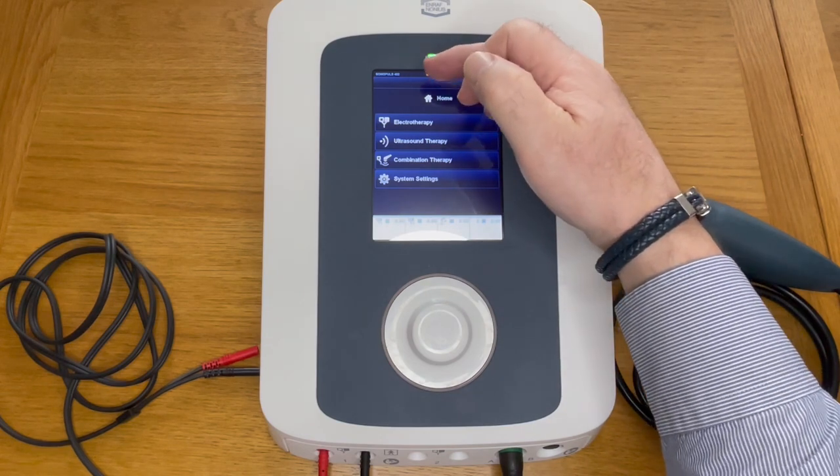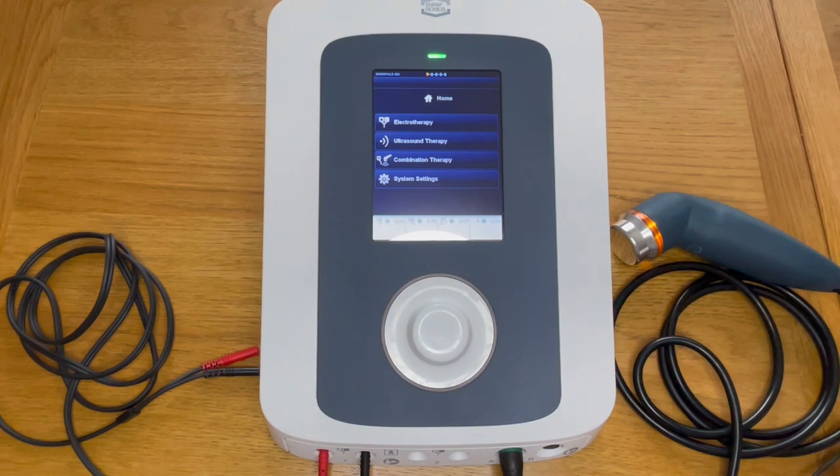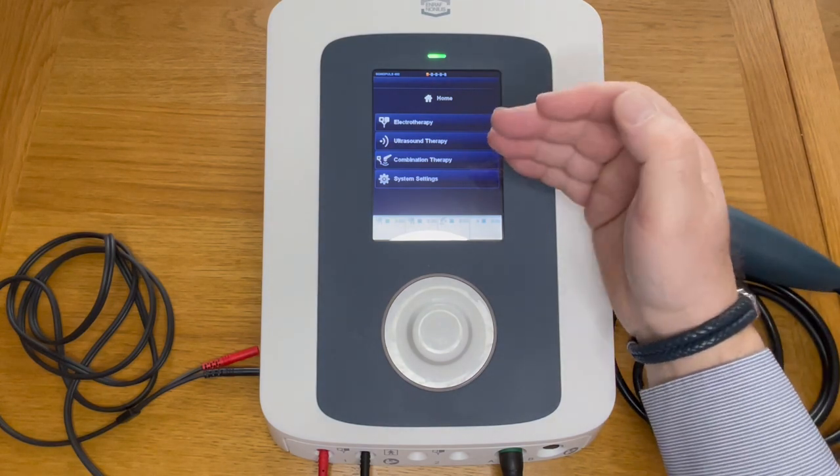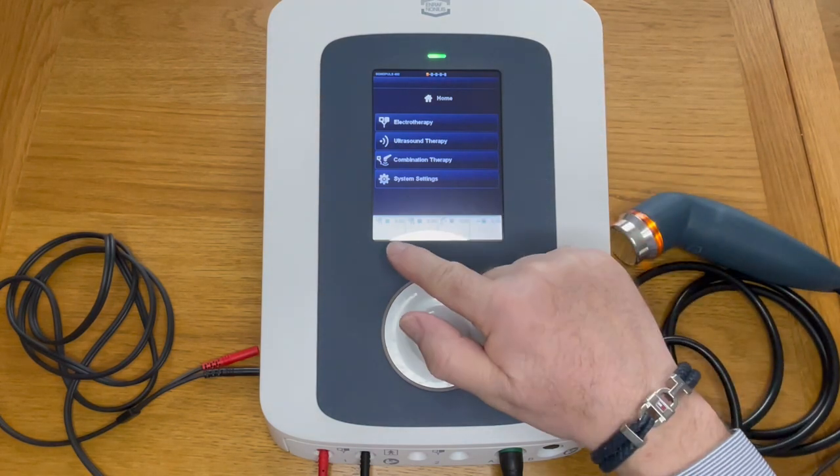On the display you can see we've got a home screen. At the top of the home screen we've got little key bars that will tell you how far you're into the menu and how far you are into each section.